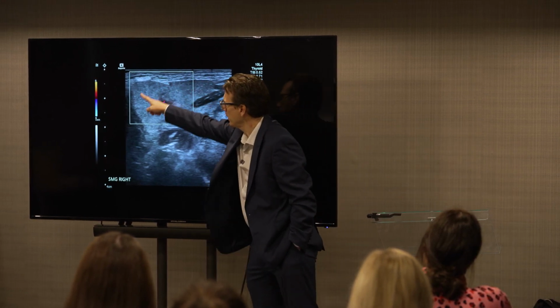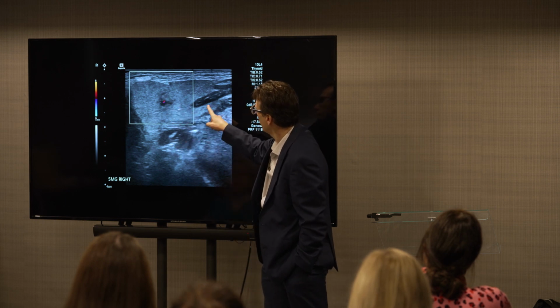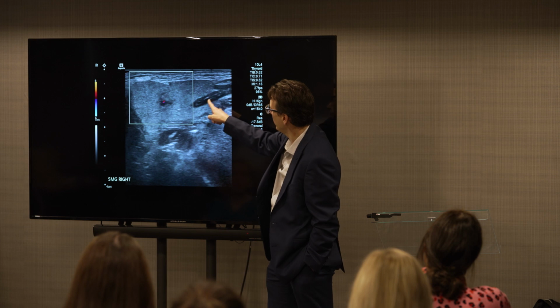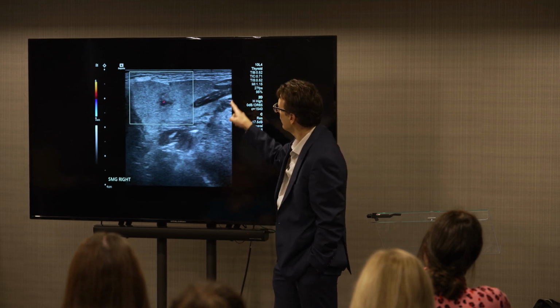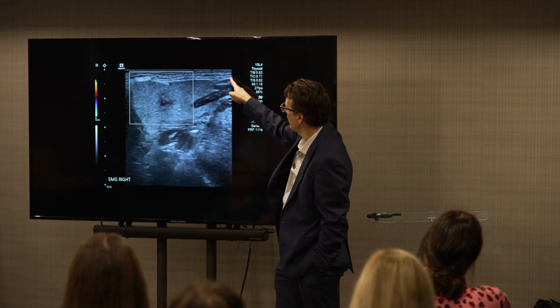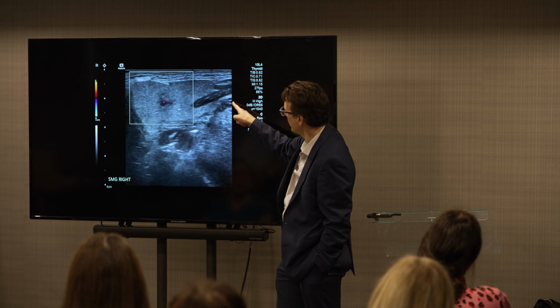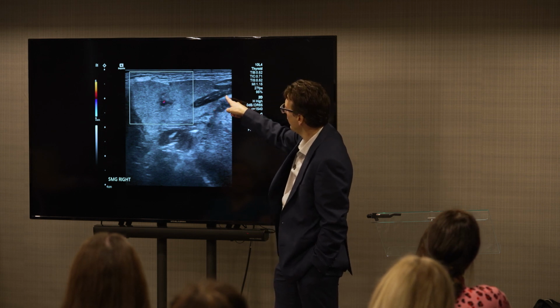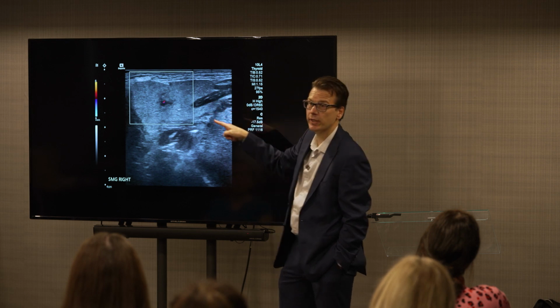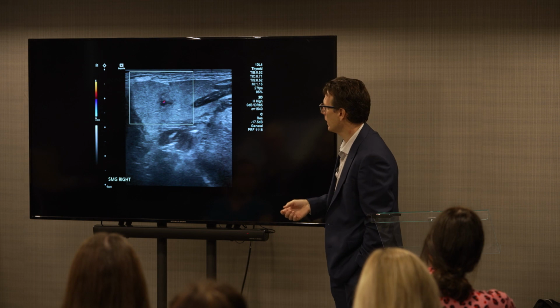So here's your submandibular glands, partial voluming of some facial vessels, and you can see that this is the mylohyoid muscle. The gland curves around the back. So just here you can see that anterior digastric, mylohyoid, and just the edge here you can see hyoglossus. And through this part here is where you'll interrogate to look for any kind of duct abnormality if it's dilated. Okay.